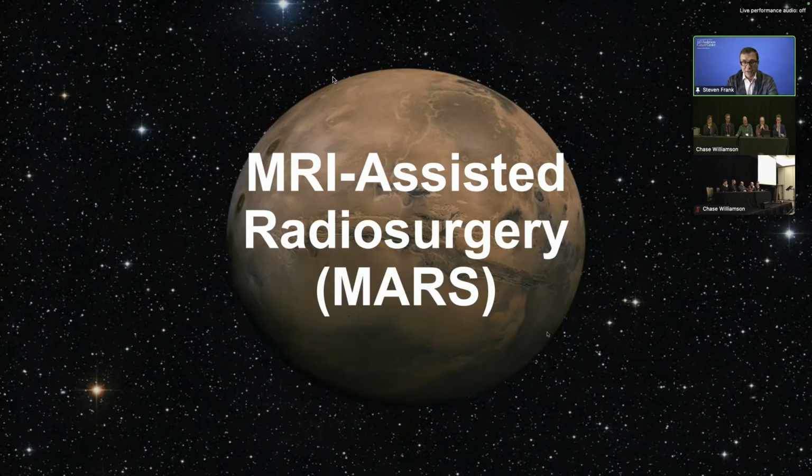It's a great question. Thank you for the question. The MRI is actually a single sequence that takes less than 5 minutes. Once the patient gets there, after that sequence, they're pulled out and brought back into the operating room. The operating room is adjacent to the MRI, and the patient is there under anesthesia and waiting.